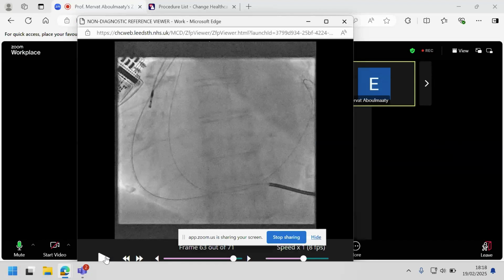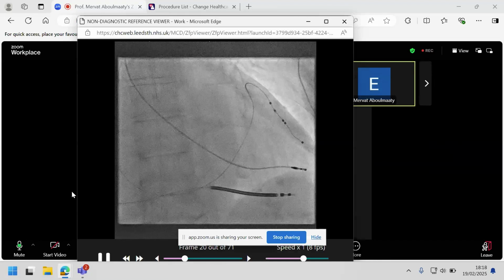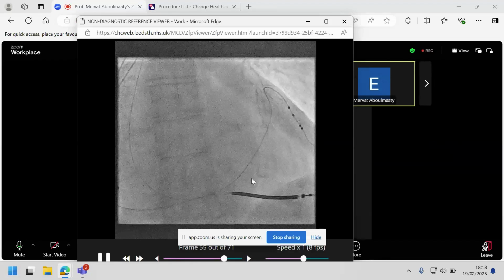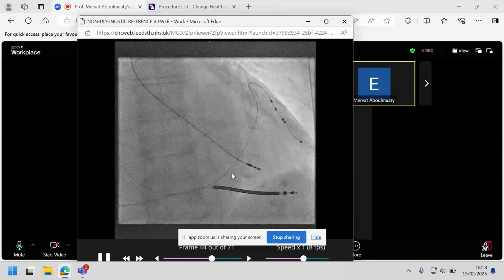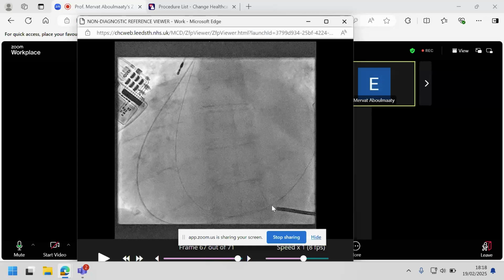Yes. So this was a particularly challenging case because this patient had an extraction, and they had atrial fibrillation and severe tricuspid regurgitation. I want you to appreciate that here, where unfortunately the radiographers decided not to save any images, we only do fluorograbs. I hardly do any cines, but you can appreciate in this patient with a huge right atrium the sort of reach that you need with a catheter to get into the RV, as well as getting into the coronary sinus.